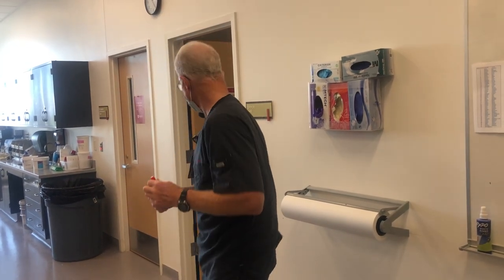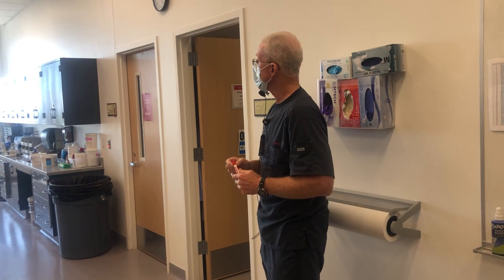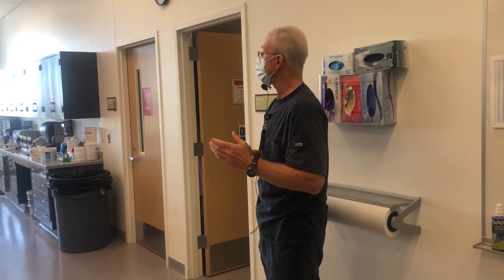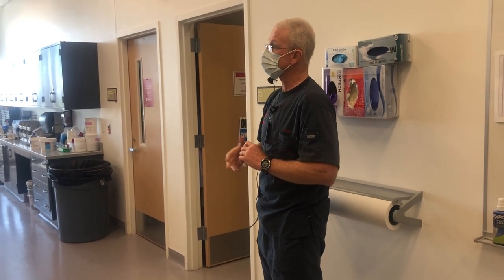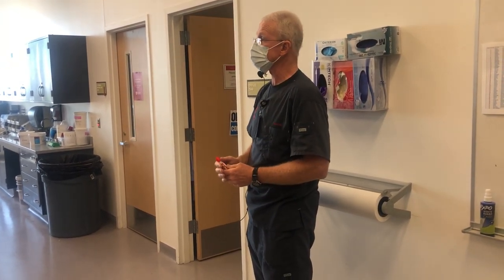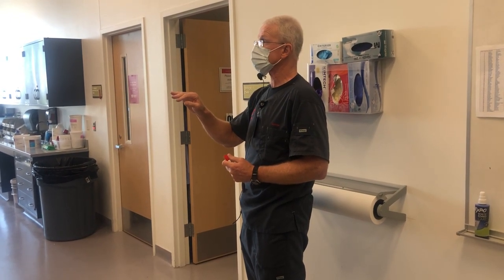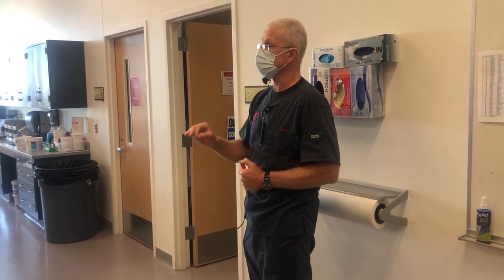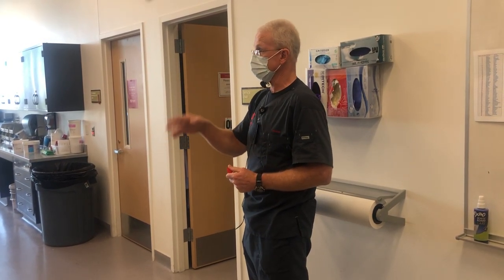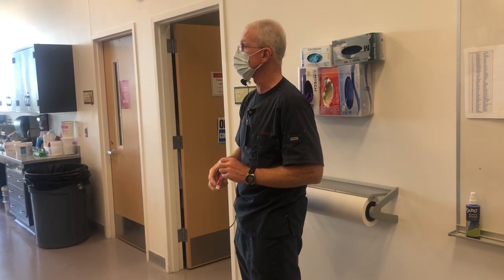Dr. Spatznegger, do you recommend the rounded shoulder? Only when you're doing lithium disilicate restorations. And you can use the rounded shoulder, and some dentists are really good at it, just don't J-lip it. You do have to watch out for J-lips. It's a harder preparation to master than the chamfer is. The chamfer, for most of us, is a little bit easier, a little bit quicker.